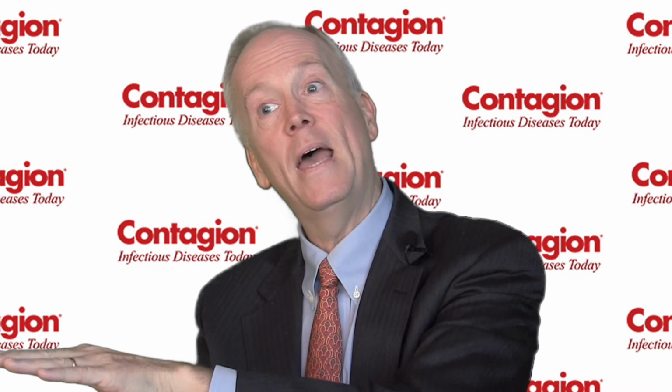So we took a cover made of the same material as these high-end mattresses, so it's breathable, okay? So it helps prevent pressure ulcers just like the high-end mattresses. And we cover the mattress, and we also cover the bed deck. That's the metal that the mattress sits on.